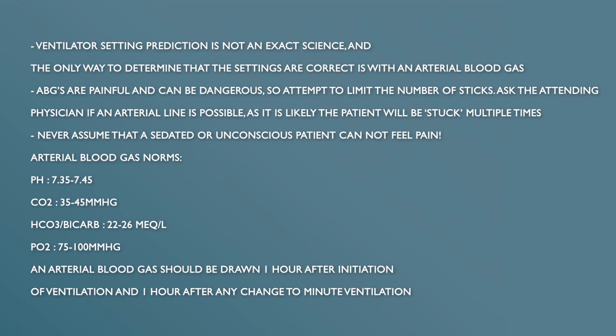When we have a patient on 100% FiO2, sometimes we're going to see that number very, very high. A lot of students and new clinicians are surprised to see PO2s above 300 or 400. They can go far above 100. Saturation is a percentage. It can never go above 100. But we do need to be cognizant of that PO2.